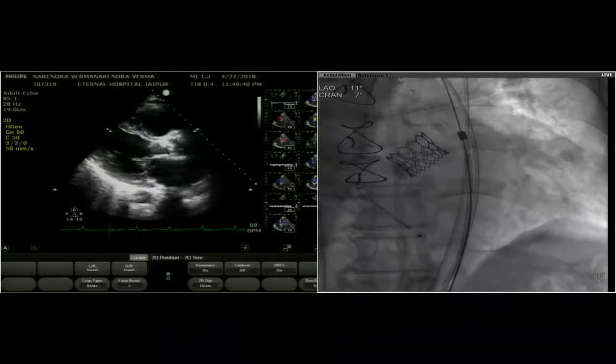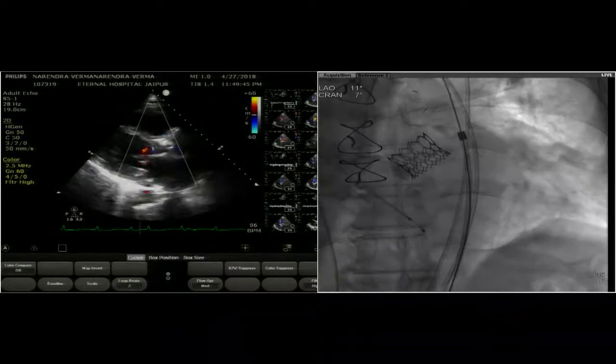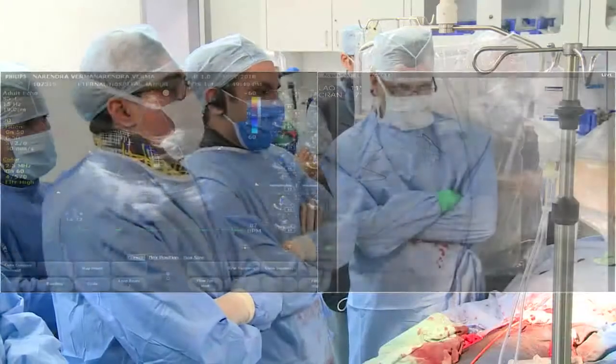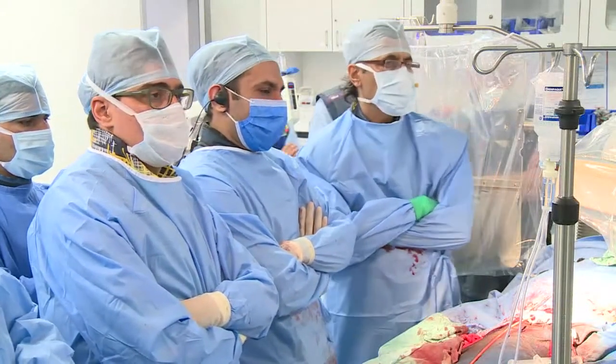not a highly selected patient for a live case. And ECG is absolutely normal, no broad QRS, with a very small aortic valve. Thank you so much, Dr. Giza. Calcification, so congratulations.